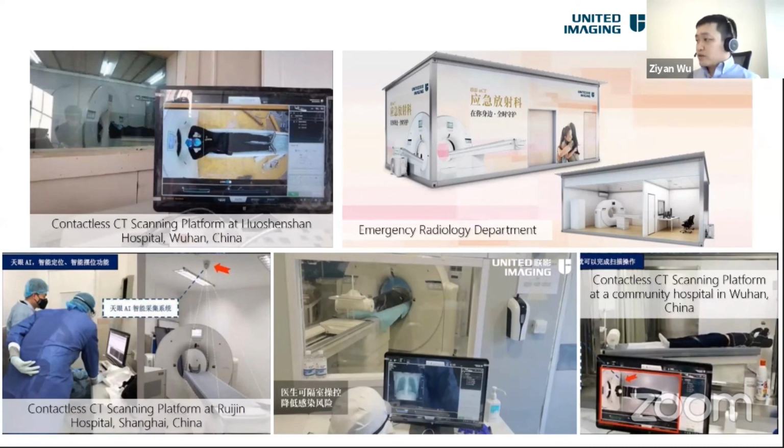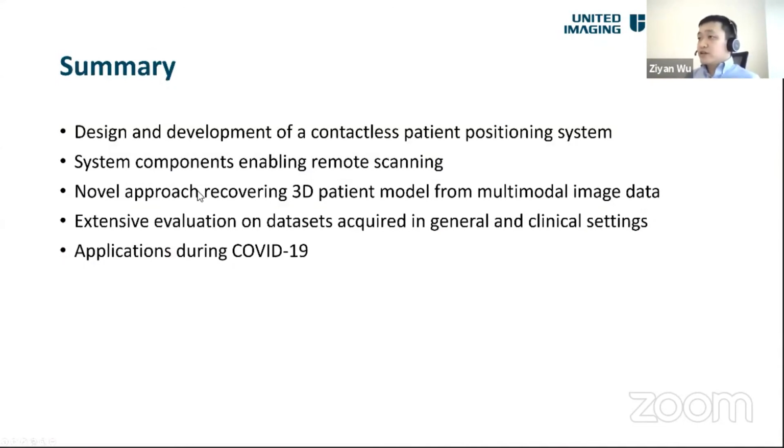We hope that this kind of system can become more popular and can help to protect more technicians in the future. To summarize, we have designed and developed a contactless patient positioning system, and we describe the design and development of the system components enabling remote scanning. We have proposed a novel approach to recover the 3D patient model from multimodal image data. We have conducted extensive evaluation on several data sets in both general settings and clinical settings. And we also showed how it can be applied to various applications during COVID-19.